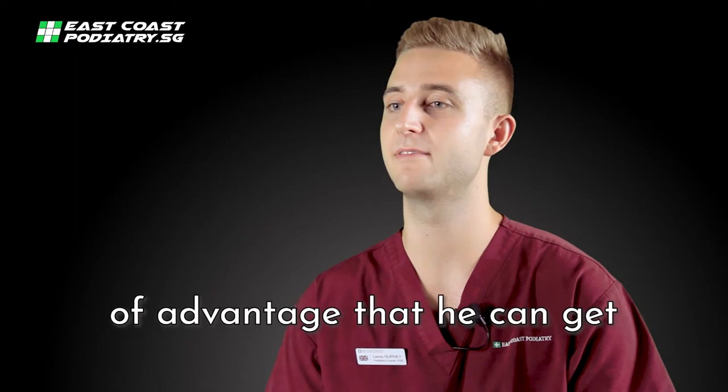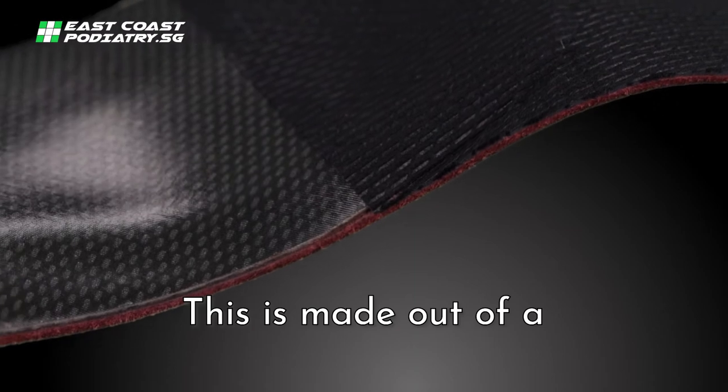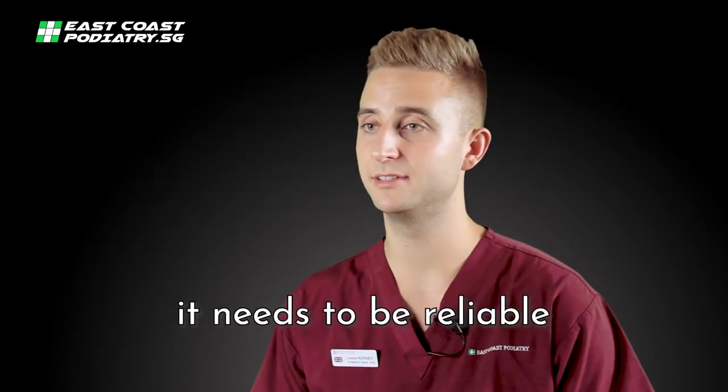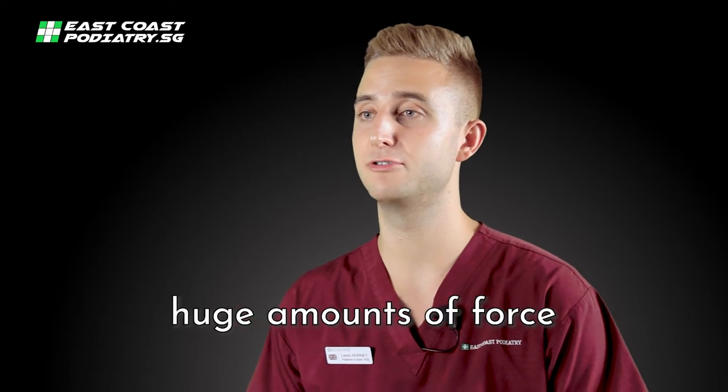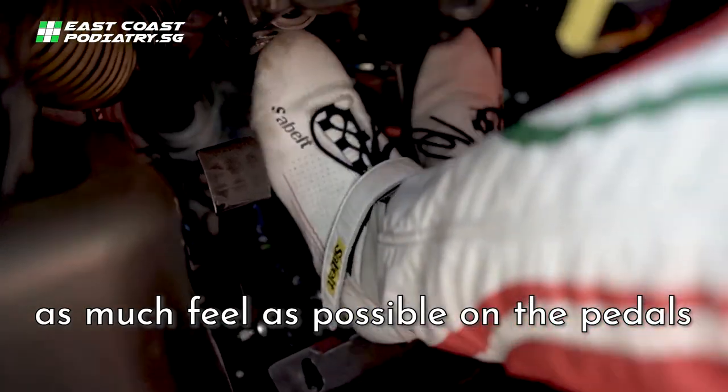The driver needs every bit of advantage that he can get to make that difference. The main structure here is the shell, made out of a carbon composite material. And this is the challenge — it needs to be reliable and strong enough to withstand huge amounts of force, but also be thin and lightweight enough to allow as much feel as possible on the pedals.